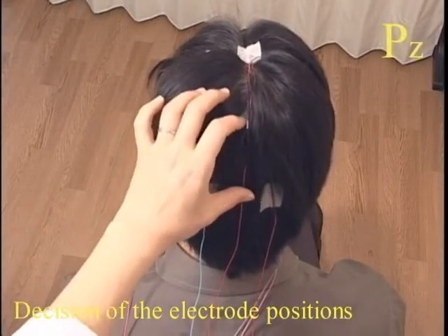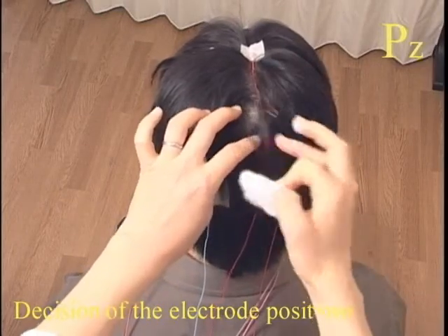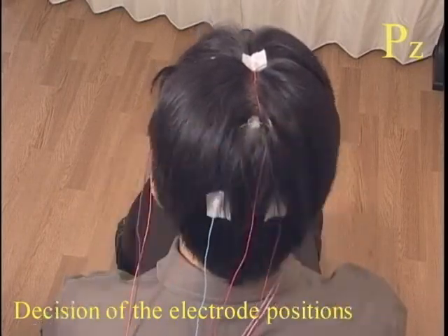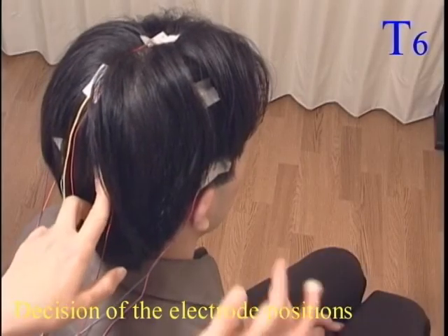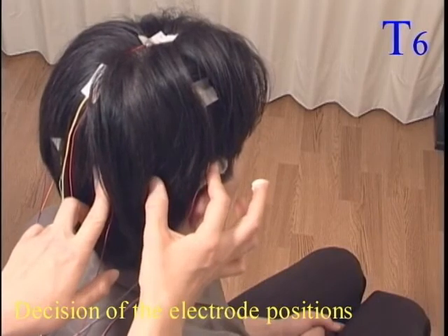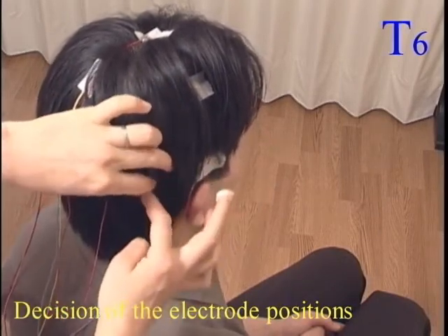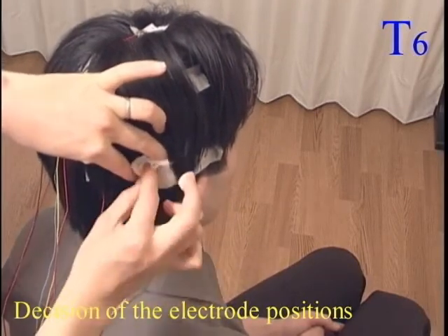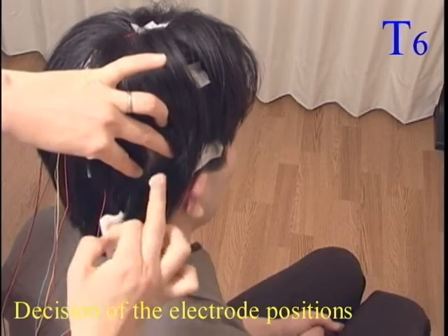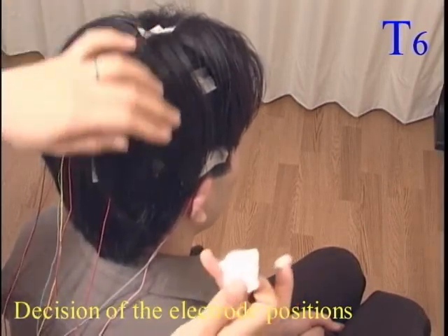After deciding the O points, the midpoint between CZ and OZ is PZ. Then the midpoint between O2 and T4 is T6. Repeat the same procedures on the left side to locate T5. During these procedures, use the lead line hanging from CZ as reference. This will ensure left-right symmetry.